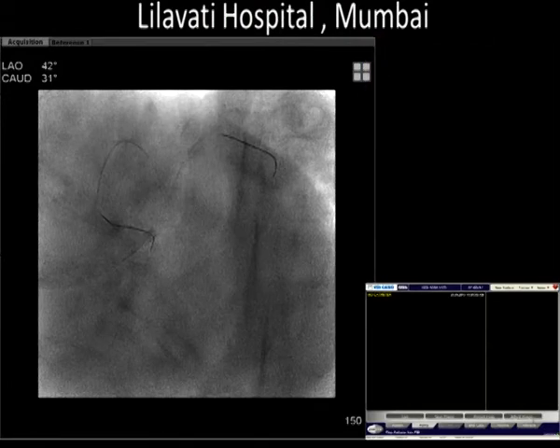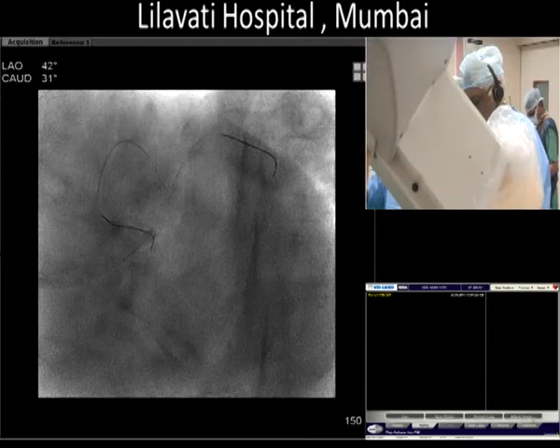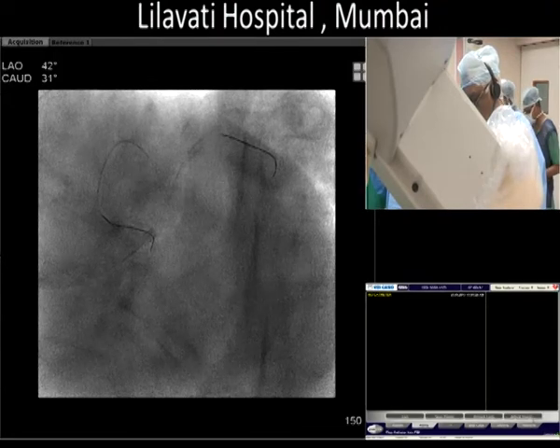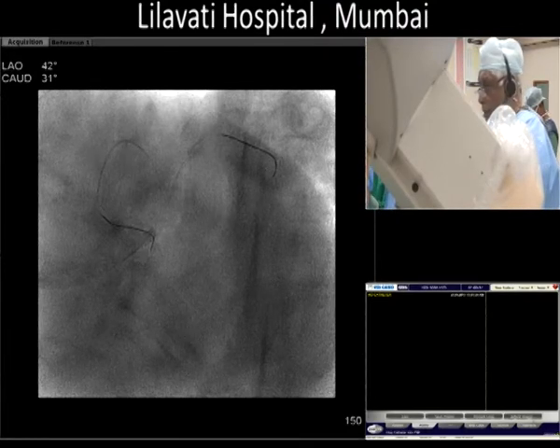Does it make a difference, the technique of post-dilatation, like how high the pressure, the ratio to the stent size, is doing it 3 times instead of 1 time? A good question. I think that technique varies in every lab. What we like to do is go 1-to-1 or slightly bigger and go at high pressure. And by that I mean 16 to 18 as a minimum, depending on what it looks like inside the vessel, and making sure you stay within the stent.